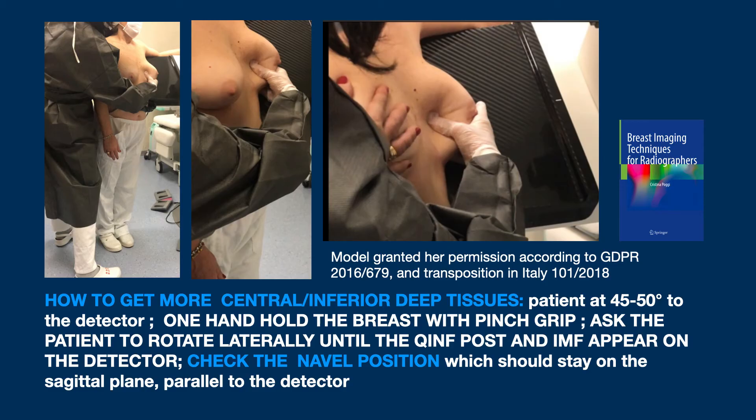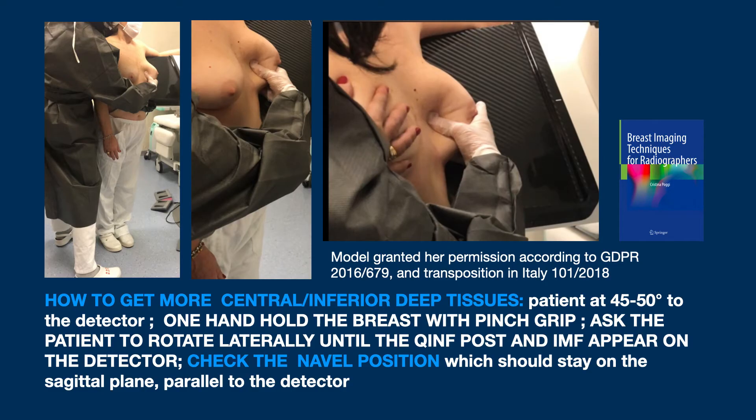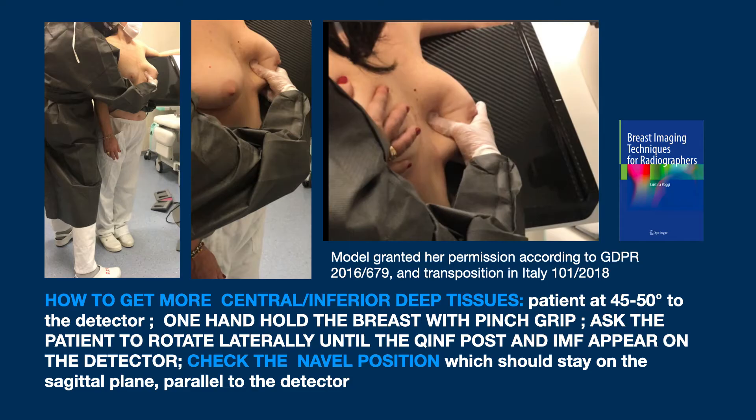How do you get more of these tissues? The advice is to position the patient at 45–50 degrees to the detector, and then turn the patient towards the detector until the median sagittal plane, where the navel is, is parallel to the detector.